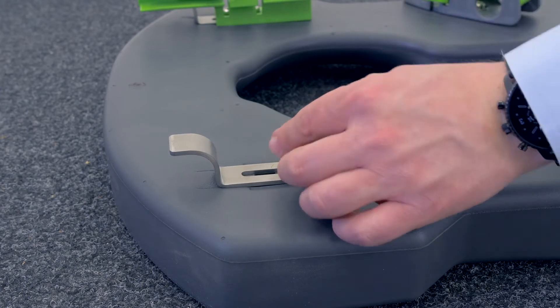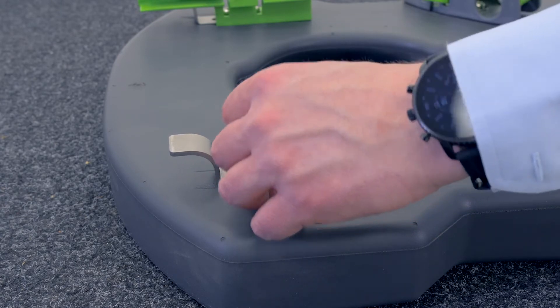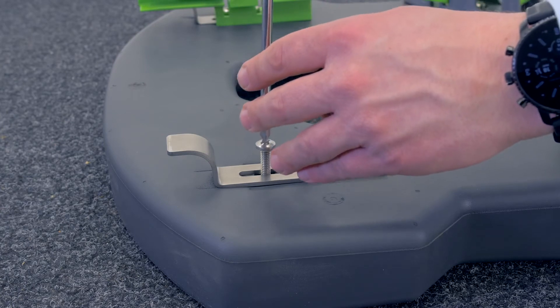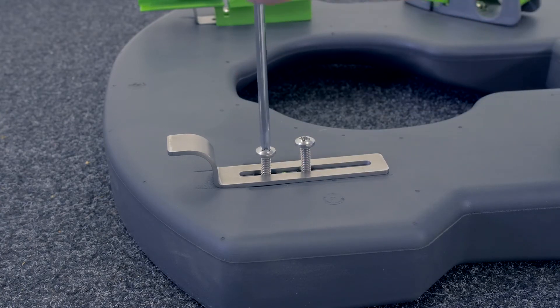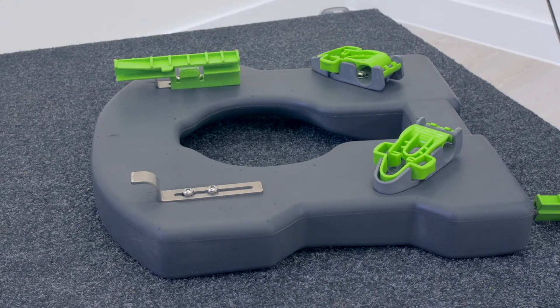Replace the screws and repeat with the matching attachment on the other side. Slide the seat back into position on the frame and fasten the green seat clips. It is important to check all fittings are secure before use.